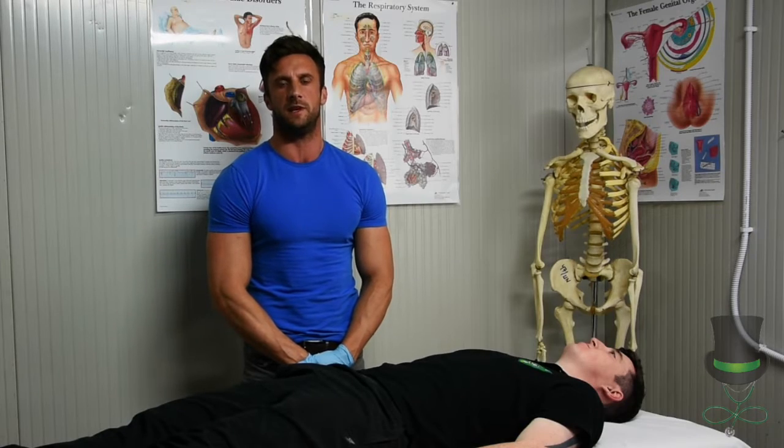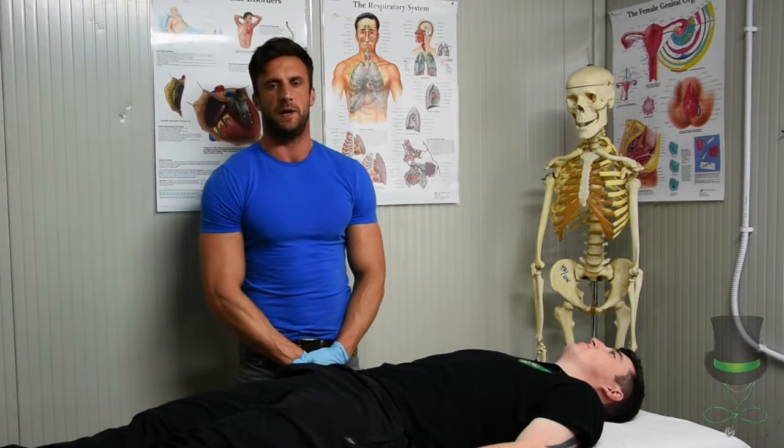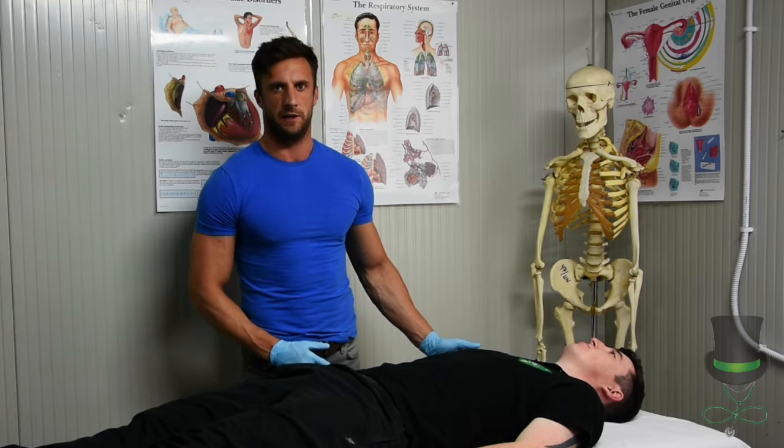Hi, I'm Frank and today we're going to demonstrate eye irrigation. You can position your patient either in a lying down position or a sitting up position. For this demonstration we're going to have the patient lying down.